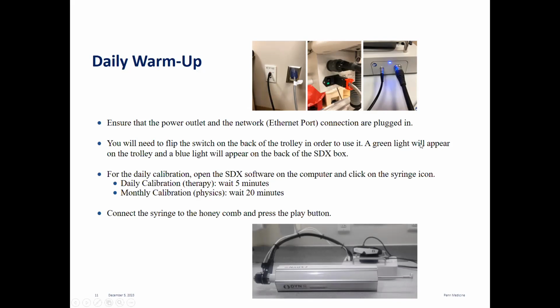So for daily calibration in therapy, you have to wait 5 minutes. In monthly calibration for the physics, you wait 20. Connect the syringe to the honeycomb and press play.